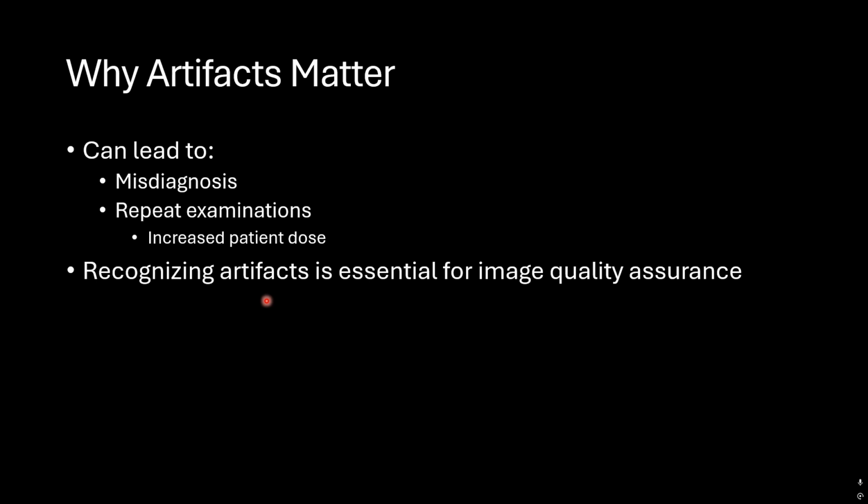Why do we care about artifacts? Because they can lead to misdiagnosis or repeat examinations, which will increase the patient's dose. Recognizing artifacts is essential for image quality assurance. So artifacts will reduce image quality, which will affect the diagnosis.